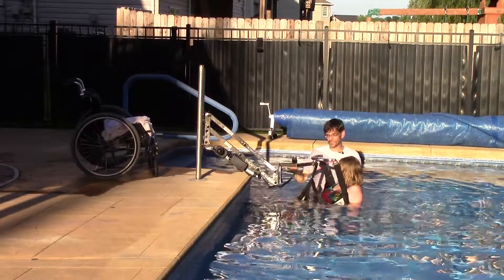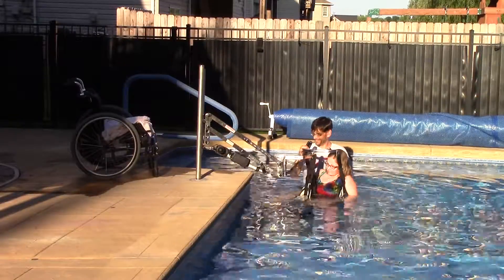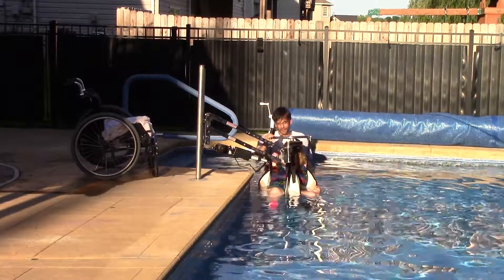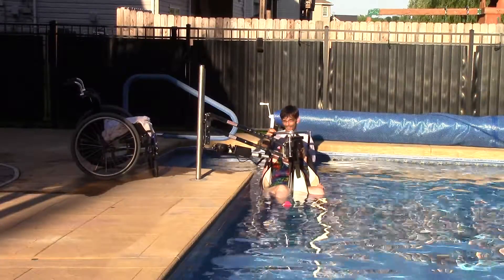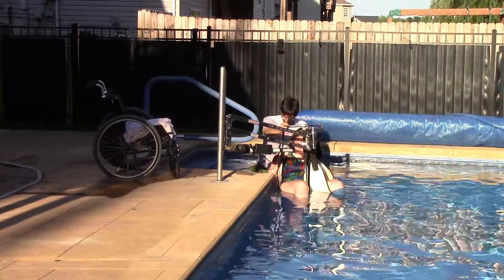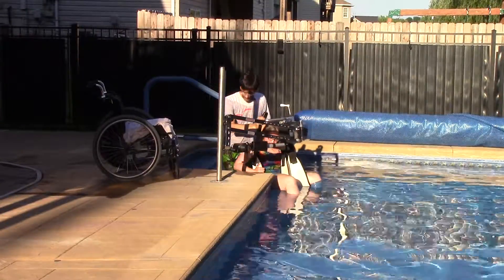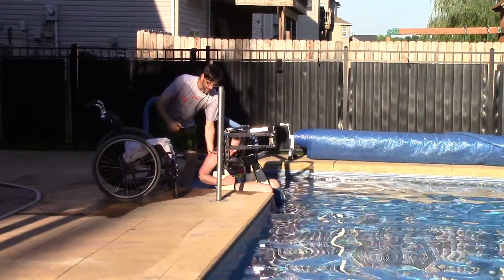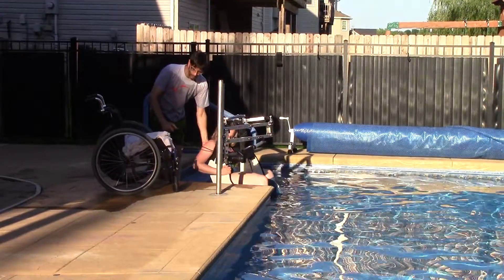Our next step is going to be to raise, and we're going to walk right toward the outside of the pool. If you have a ladder in your pool, then you'll have to sit on the deck and do this from a position. Here we've got stairs, which is real handy for walking out. And just step by step, we go up and out of the pool.